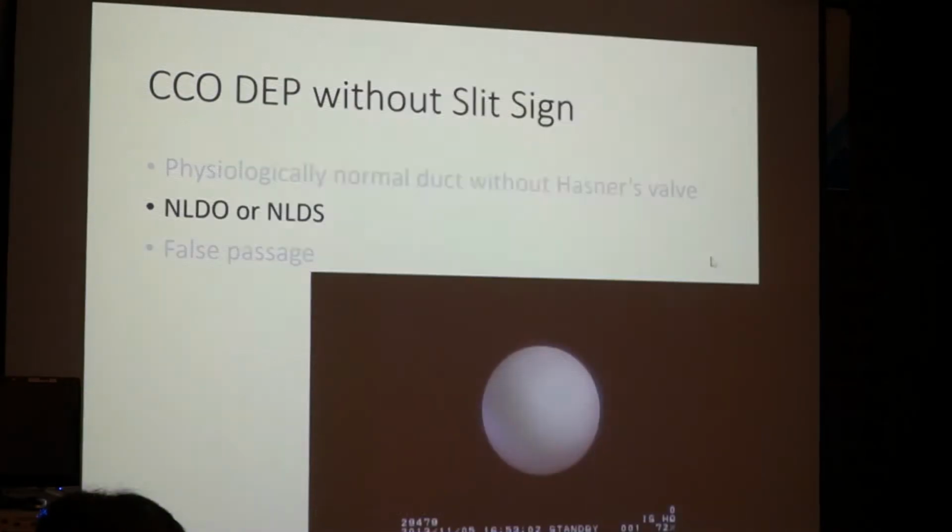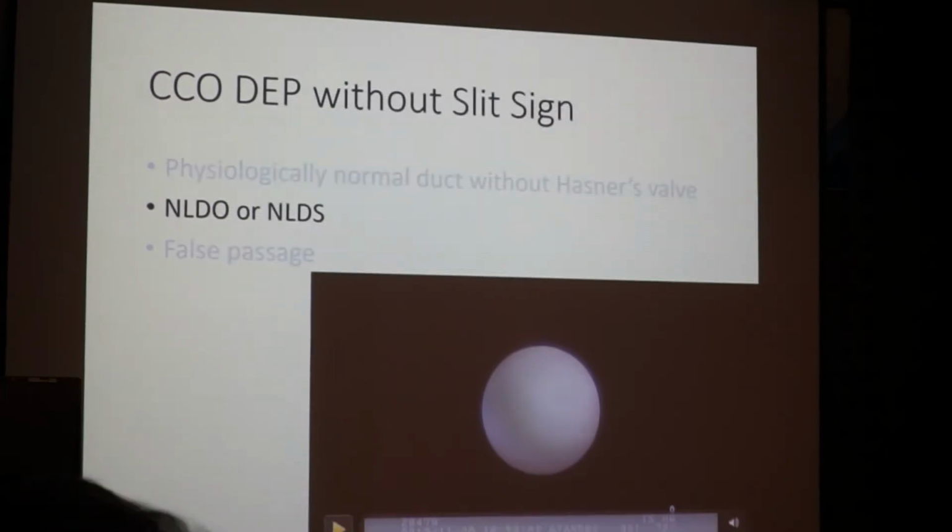This is no problem. But the second condition is a little bit problematic. We have to think about ductal conditions such as obstruction, stenosis, dacryocystitis, or something. I'm going to show you one example.